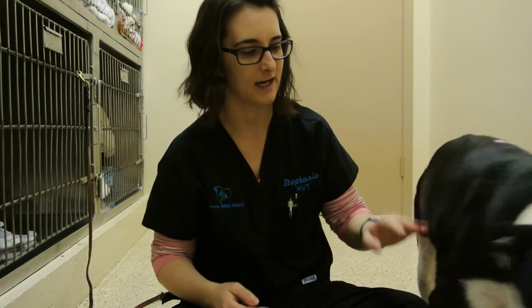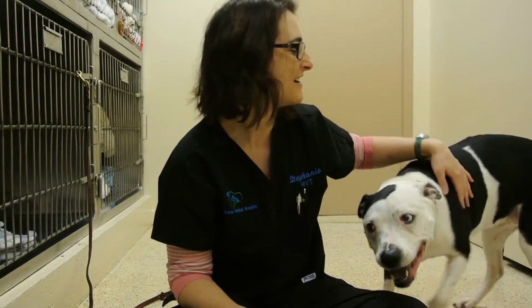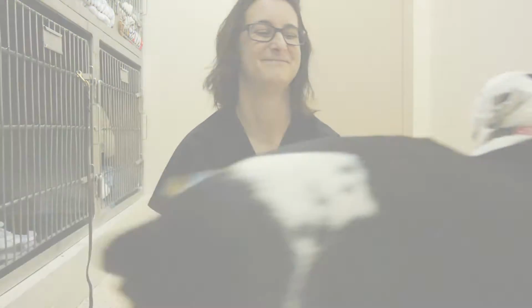She has started peeing all over the house, and she pants excessively, like you can hear. She's also very hyper. And her liver enzymes and her pancreas enzymes are slowly climbing high. So she's getting a full abdominal ultrasound today to hopefully determine what's going on with her. We'll see how this goes.